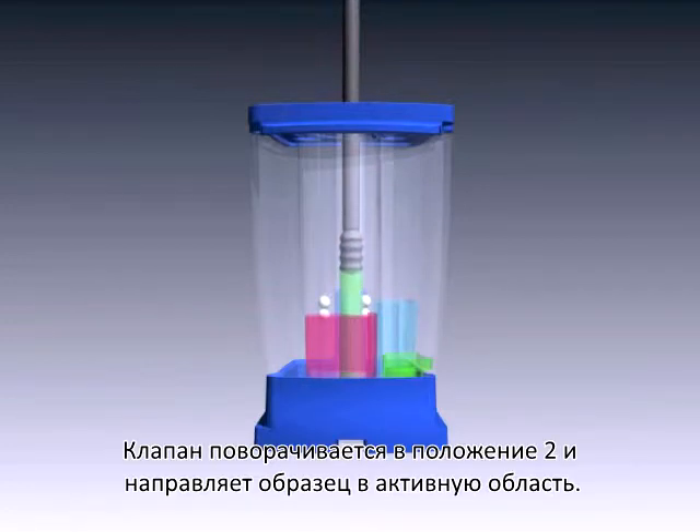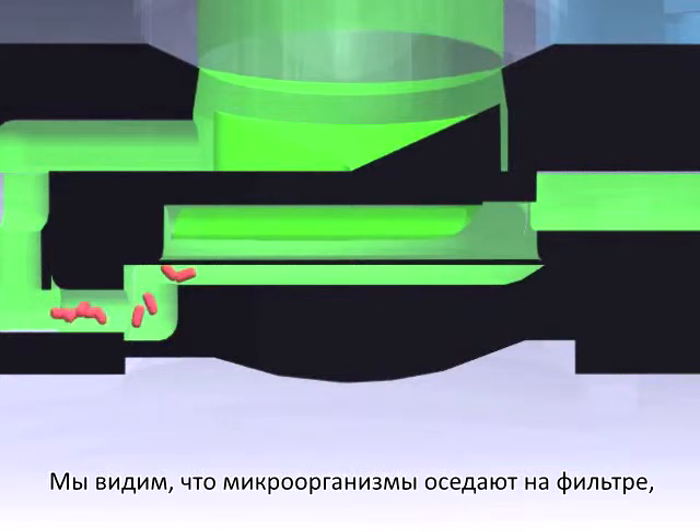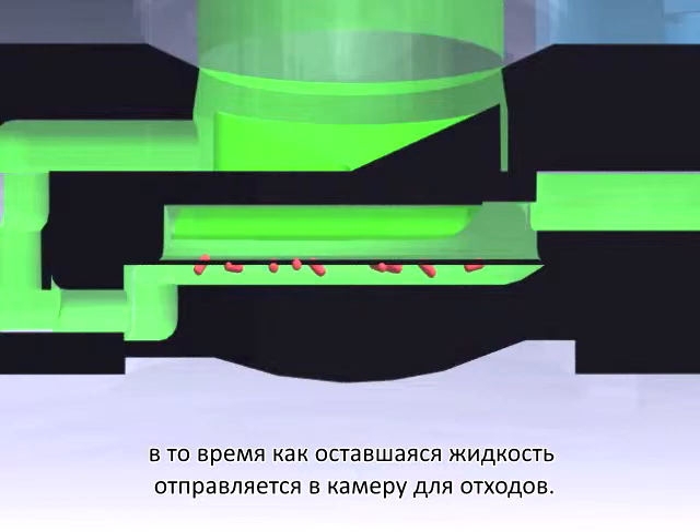The valve body rotates to position 2 and dispenses the sample through the active area. Here we see the organisms being trapped on the filter, while the remaining fluid is dispensed into a waste chamber.